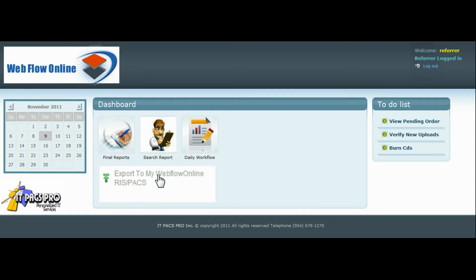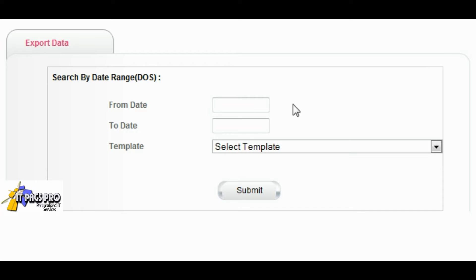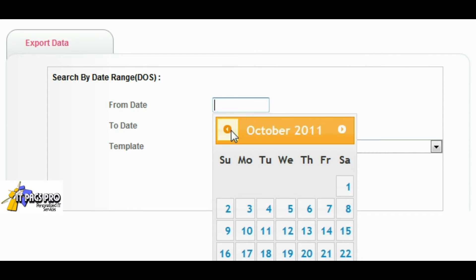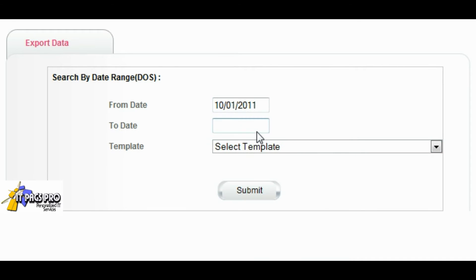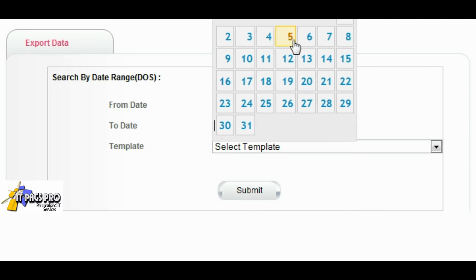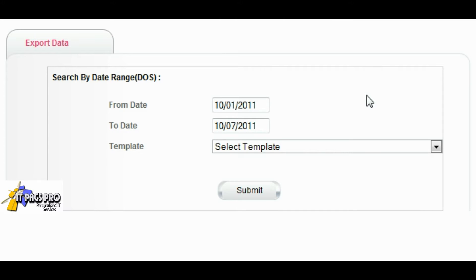The imaging center staff will log into the radiologist webpage, click on export to my Webflow, choose a date range, and the account they wish to export. This can be done automatically or the imaging center can go in and manually do this.